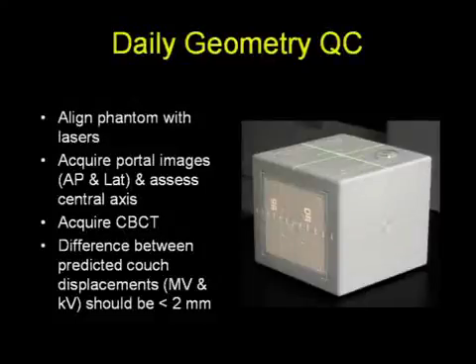It's my opinion that just as dosimetry is checked on a daily basis on accelerators, the geometry of these devices should be checked as well. And here I would like to disclose a commercial interest in this Modus Pentaguide Phantom.